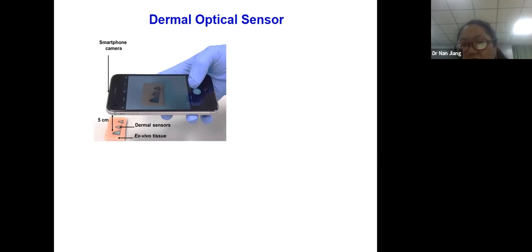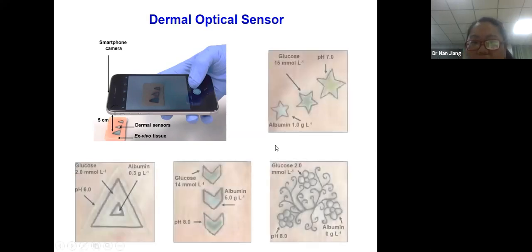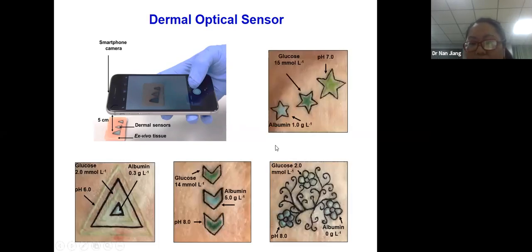Another limitation is the distance. Sometimes we have to make portable devices, as I showed in one of our slides. With the portable devices, we can control the distance for the images, and if we control the distance, we can also get a more accurate result. So if we sort out all these challenges, I think it can be commercialized in a very near future.